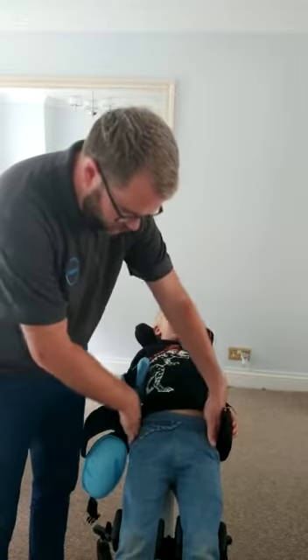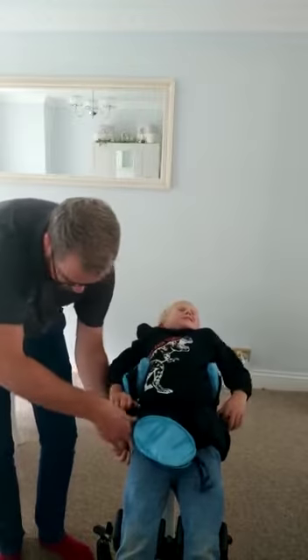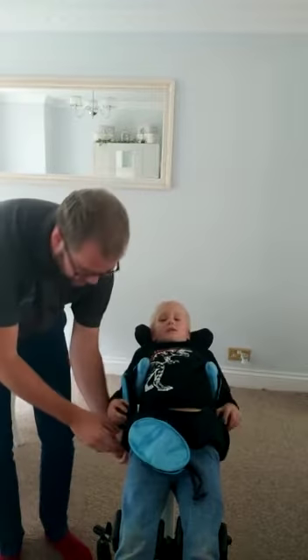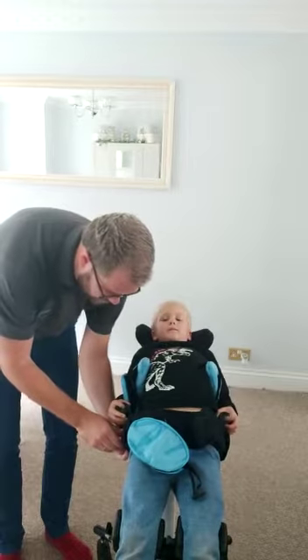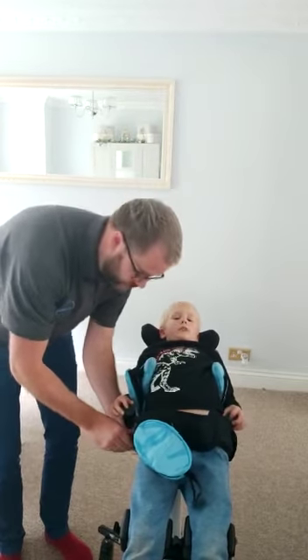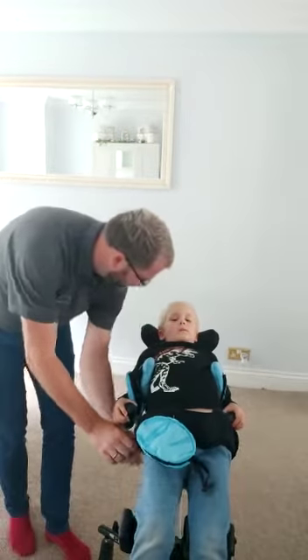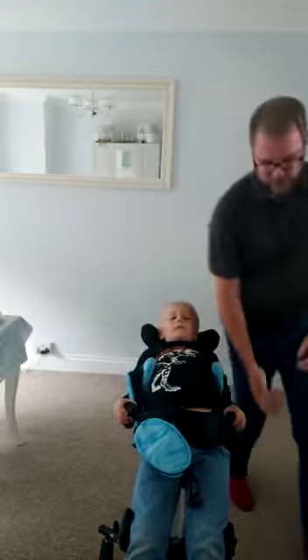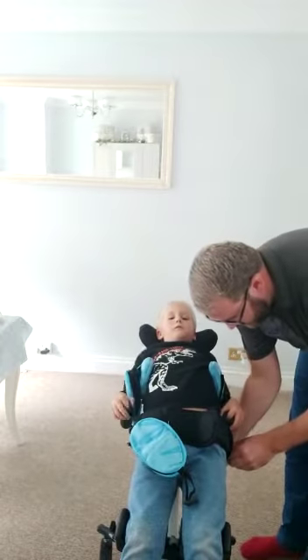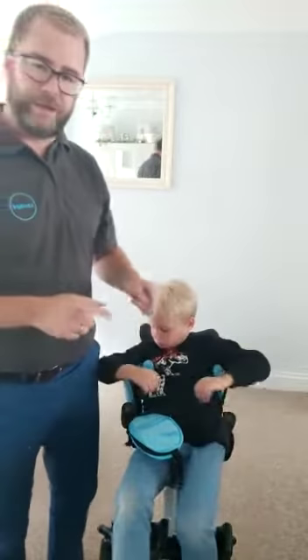If you think there's too much gap down the sides, there's just a little thumb screw under here just where the pelvis is, and you can see that move in and out like so. Push that in, tighten it up, and the other side — tighten that up also. You should just be able to get a finger down the sides.